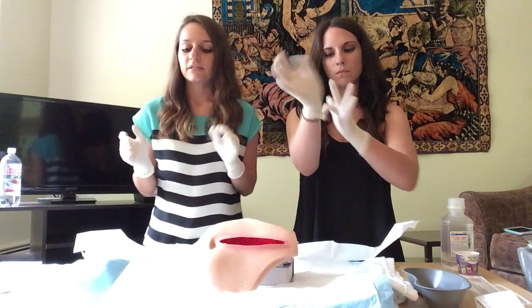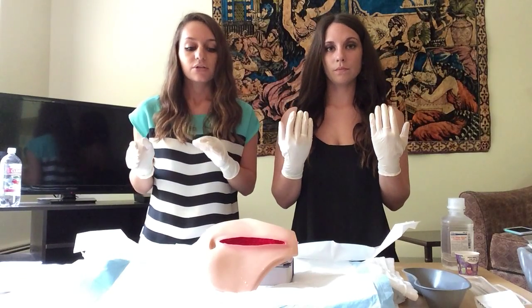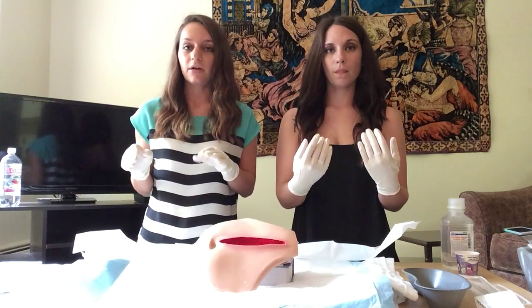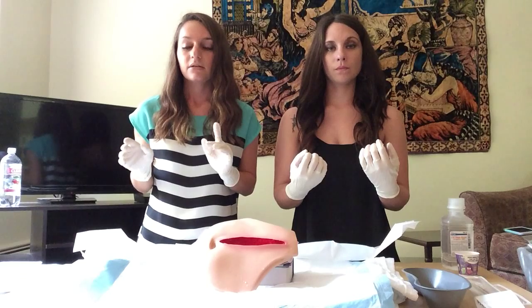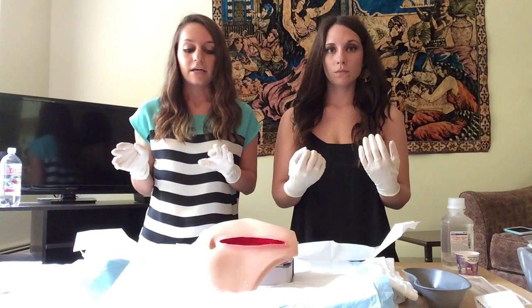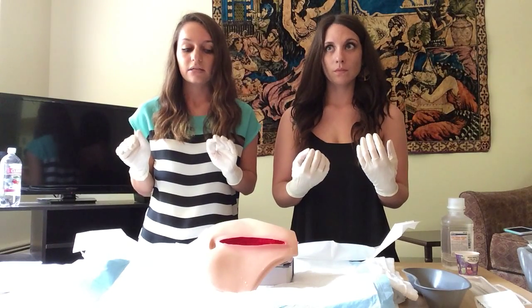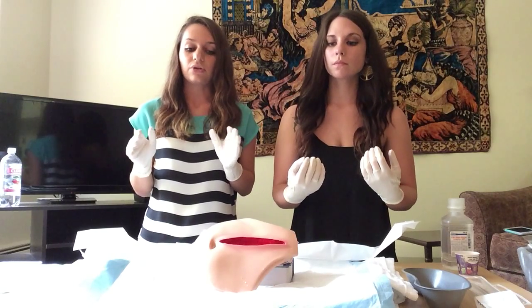Now that our sterile gloves are on, we can take a look at the wound to do a quick assessment. A helpful nursing mnemonic we can use is REEDA: R for redness, the first E for edema, the second E for ecchymosis or bruising, D for drainage, and A for approximation. We're going to take all that into consideration when looking at our wound.